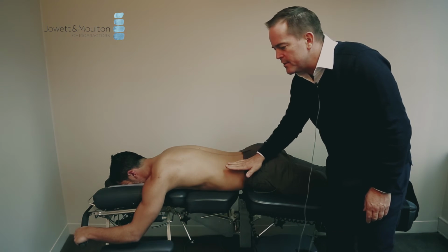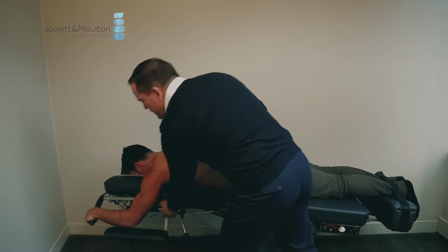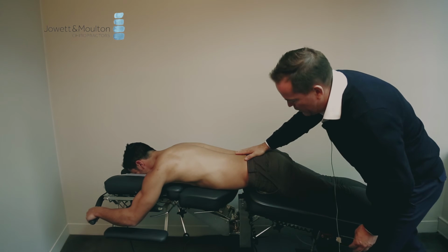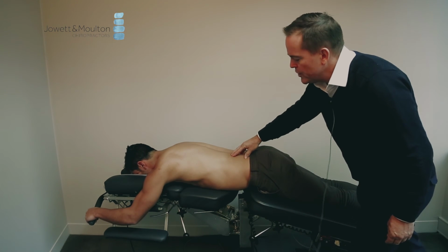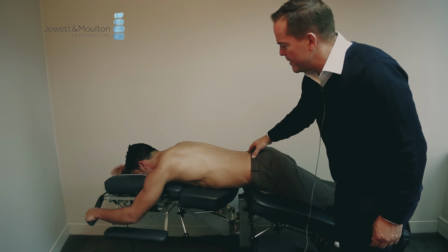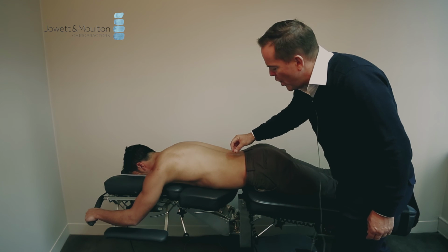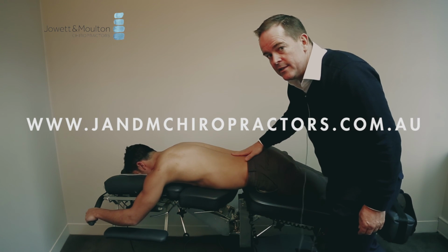If the disc is prolapsing to the left, we're going to take the table to the right to open that up further. And the table simply works by opening this area up. So it's a nice gentle action. There's a mechanism at the top that we can use to stop the table in an emergency if we need to. But it gives a nice rhythmic opening to that joint and can be very effective for these disc problems.